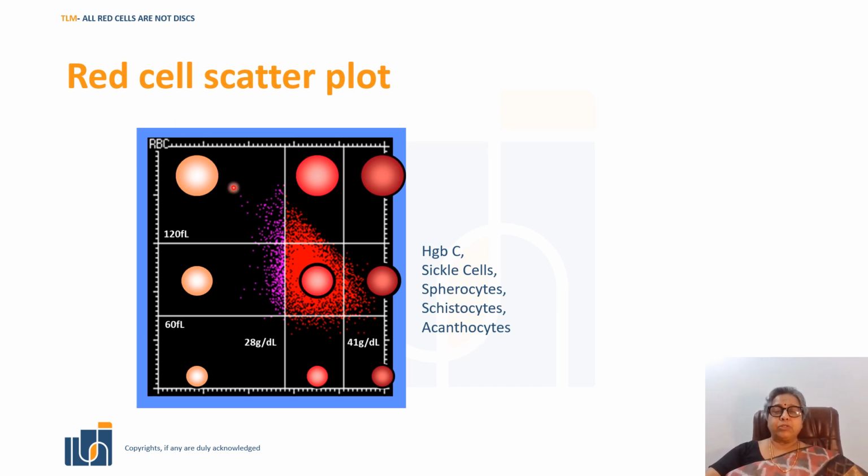Here you have macrocytes. Here you have microcytes. Hypochromic macrocytic, normochromic macrocytic, and this will become hyperchromic macrocytic. Normocytic normochromic, normocytic hypochromic, normocytic hyperchromic. Microcytic normochromic, microcytic hypochromic, microcytic hyperchromic.